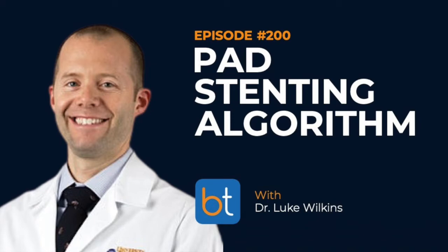I'm sorry. Yeah, and so Sahar and I developed this like 3 years ago. It was right before he left. I can't remember when that was. And we were just talking about how we noticed that there were always issues with distal embolization with these long lesions. And that was more true when we were doing CSI and lots of orbital atherectomy, and you were just creating all of this sanding of these vessels. And the longer the segment you went, the more you were showering stuff down.